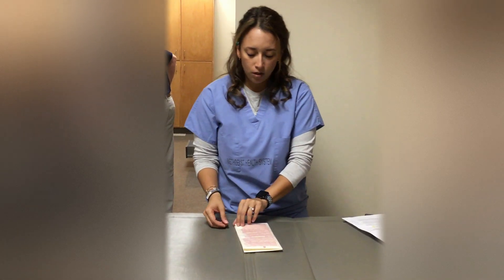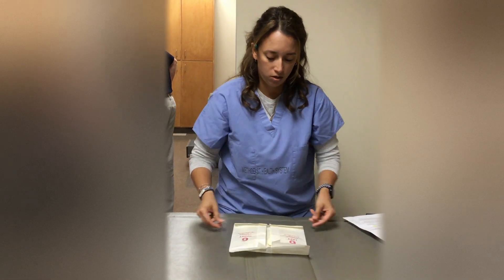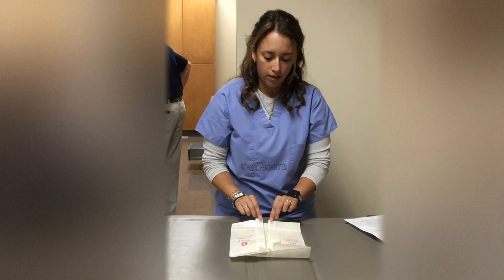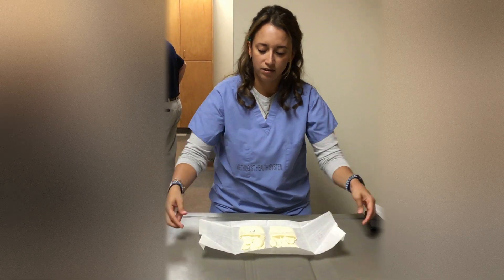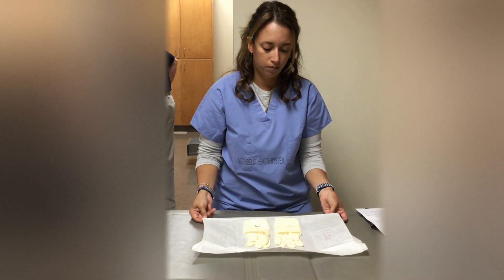Then I'm going to open it up, careful to keep touching only the outer one inch of the glove. I'm going to open up the packet, trying to keep on the very outside of the packet, laying it flat as much as possible. I'm going to clean it and let it dry.